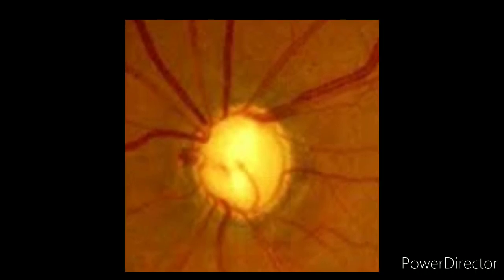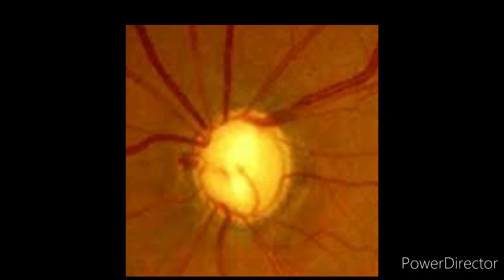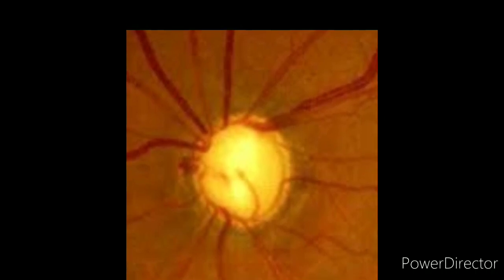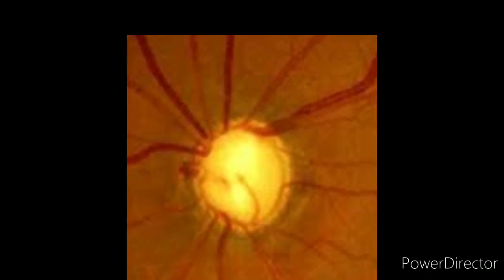So this is cup-disc ratio 0.9, almost full cup-disc. Now how to determine these? Well, for that I would like to draw a circle.